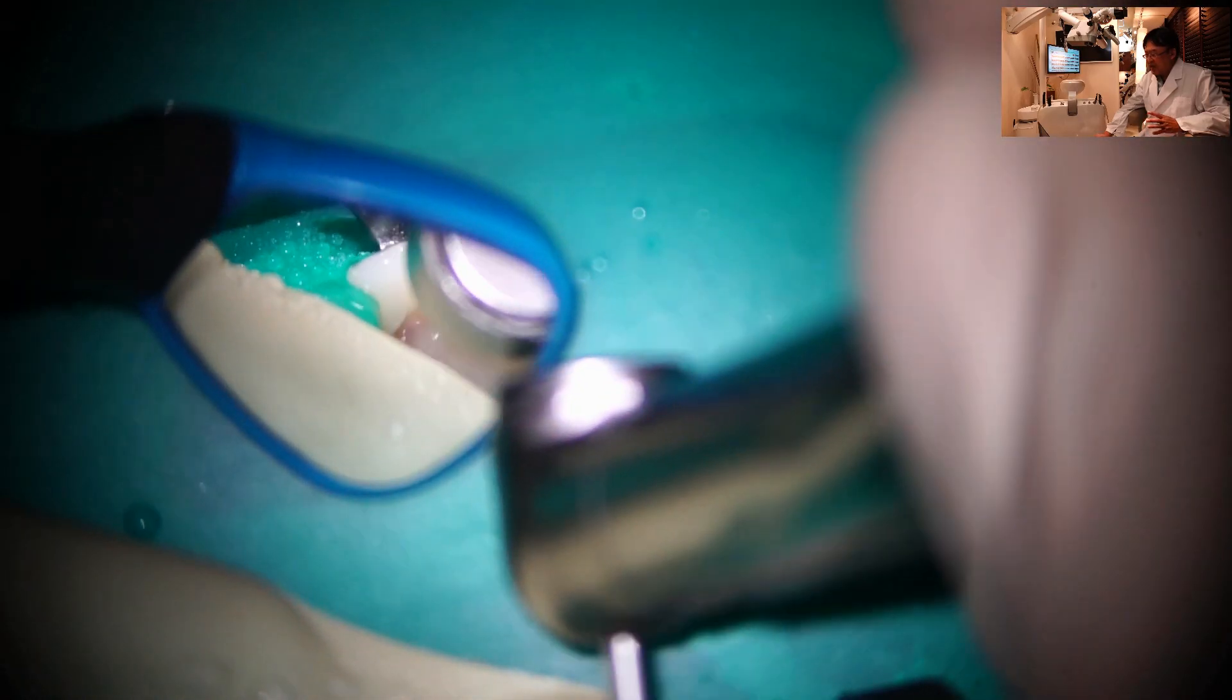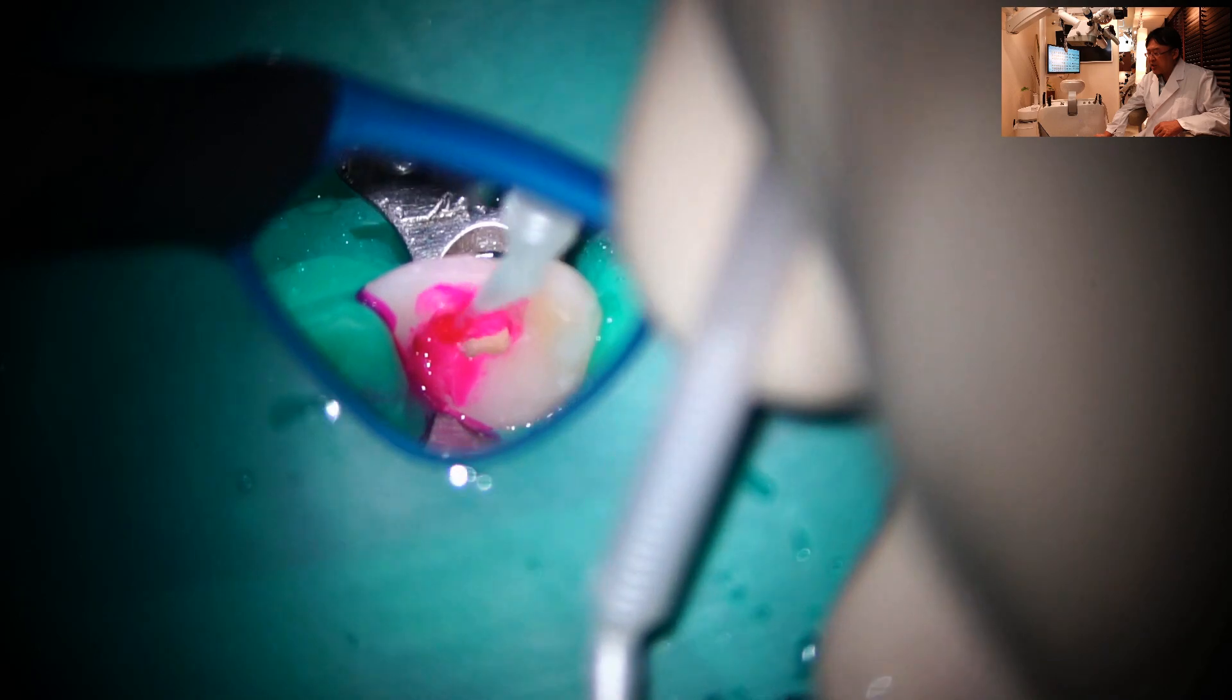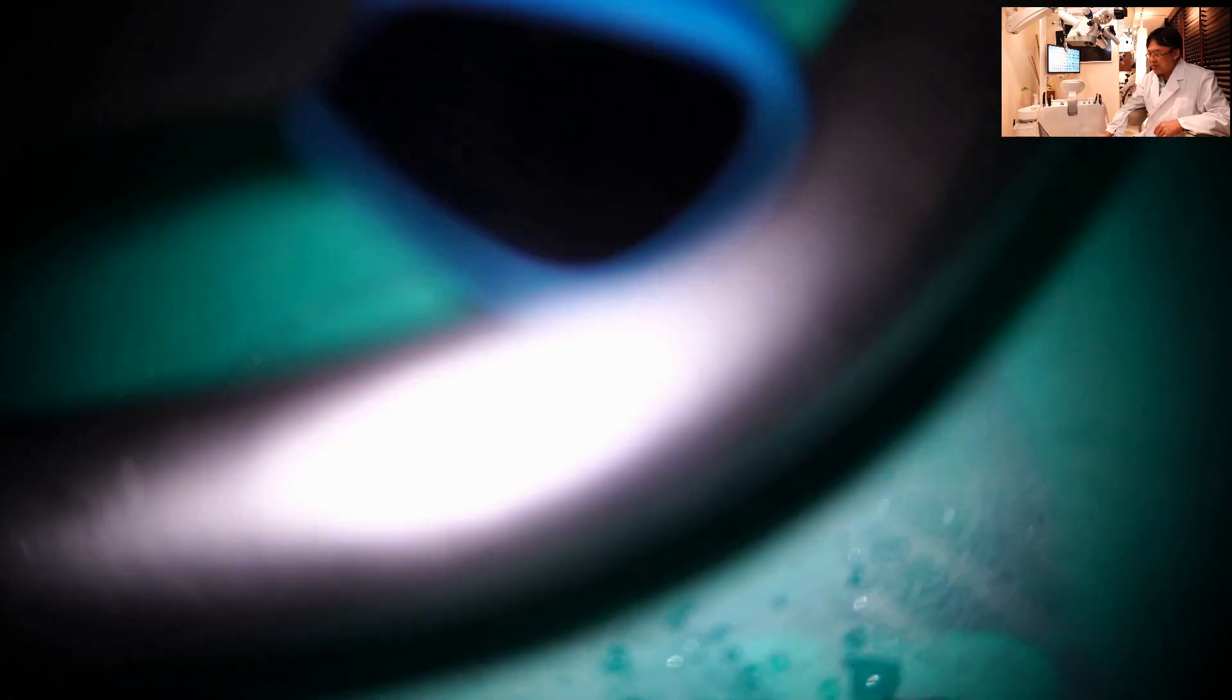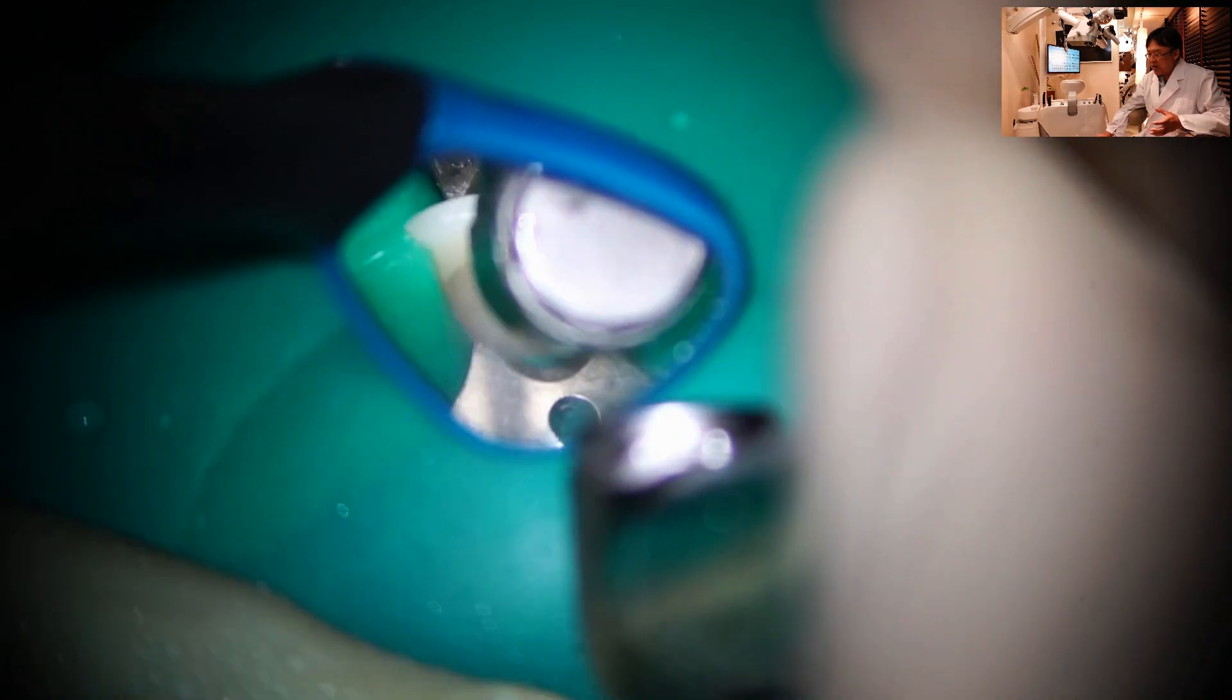I didn't anesthetize the patient. So if the patient tells me it hurts, then I can stop and anesthetize the patient. I'm using a caries detector dye so I can know where the caries is. I'm removing the dentin with red ink.